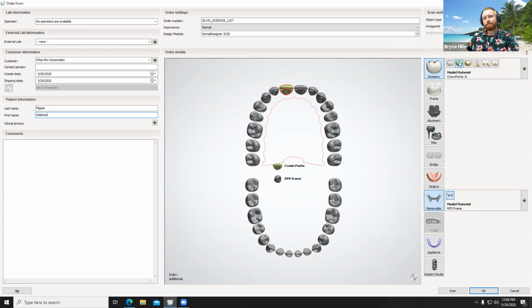I don't know, because the crown and bridge material from Denka is brand new. What are your thoughts? I would say you'd want to stick with the denture tooth material because it was validated as a long-term device, versus the temporary material, which I think is only rated for 30 days. It depends on what you want to use it for, the duration of this prosthetic. I think that's what I would go with.